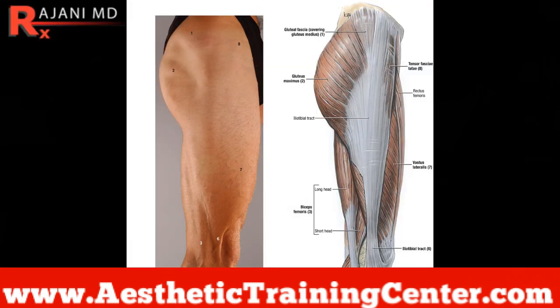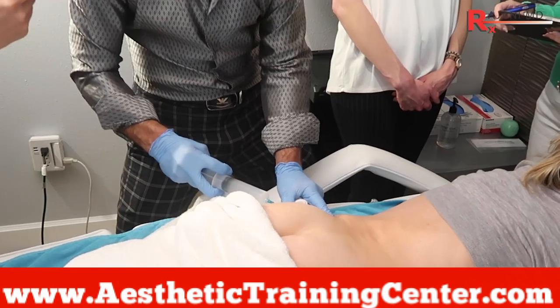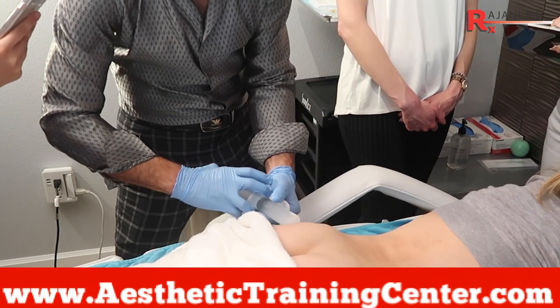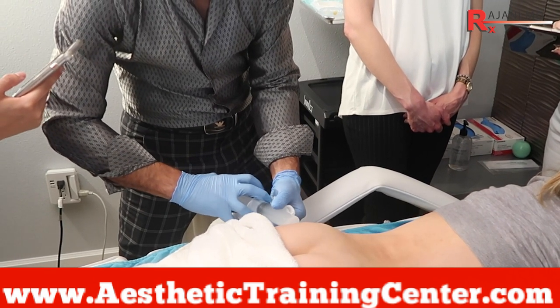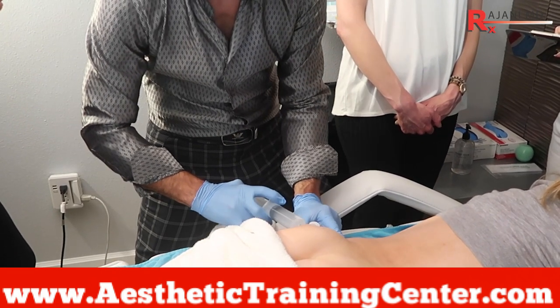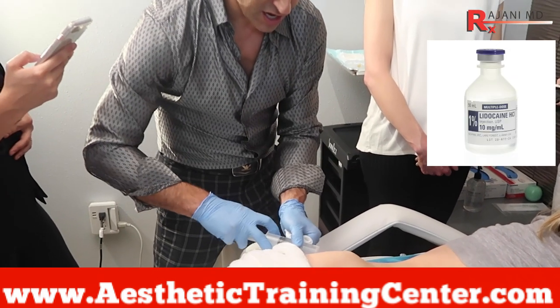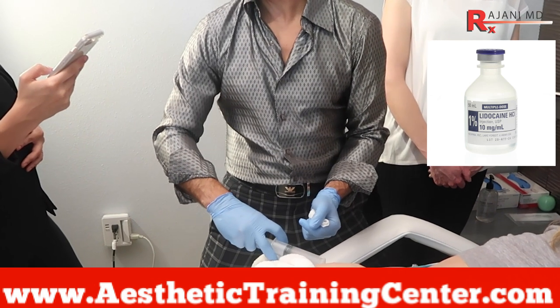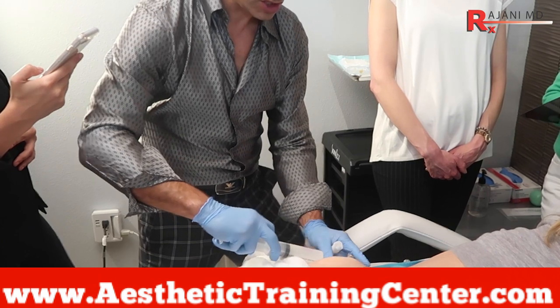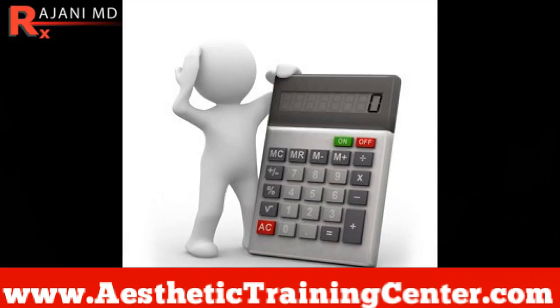This isn't an instructional video — anatomy, concentrations, and dilutions are important to know. Here I'm pushing the product in and watching where it flows. For anesthesia, you can use topical or vibration, but there's lidocaine in the mix and that makes the biggest difference. Lidocaine toxicity is important, so calculate your doses carefully — you should be nowhere near toxic levels if mixed properly. We often pre-mix in an IV bag to achieve our final dilutions.